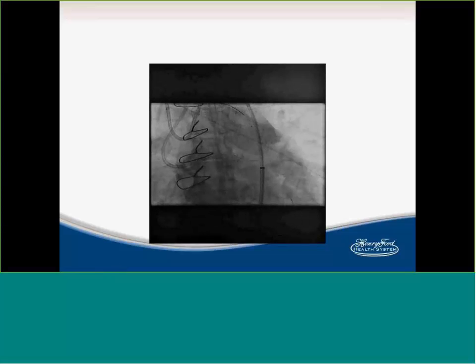Carl, did you do balloon angioplasty in the beginning? You break any balloons there just in case? I did. 1.5. I think this is the 1.5 millimeter. I could not push it at all past this point, and tried to explode it. I think I did it, or I just gave up because I could not get close to it, because this is where the Corsair stopped, and I could not get it. This is 1.2 by 20, same thing.